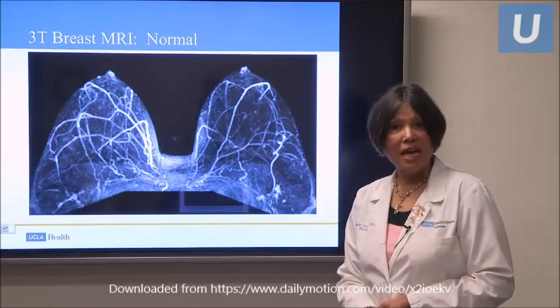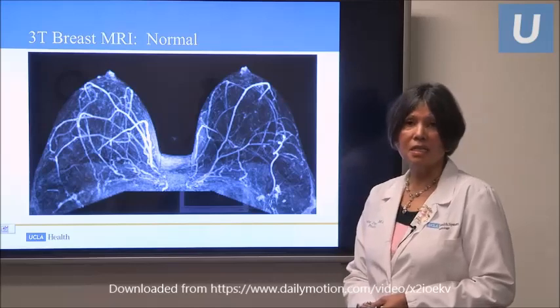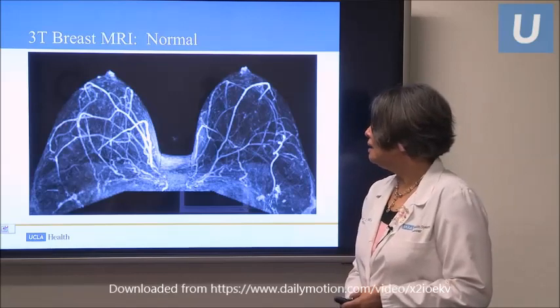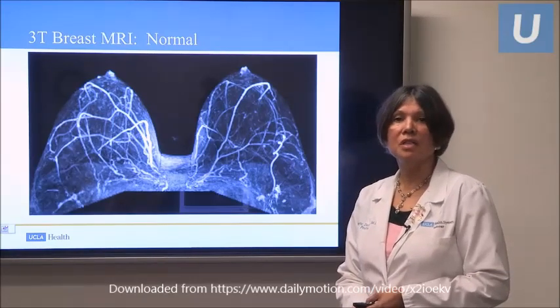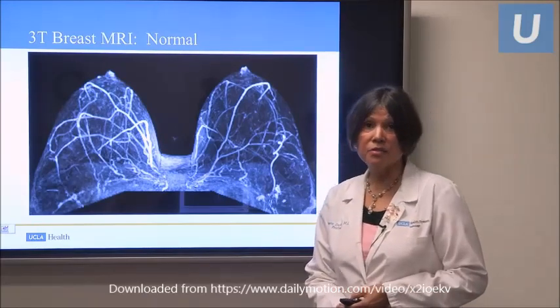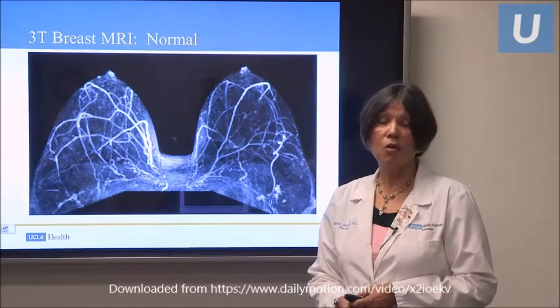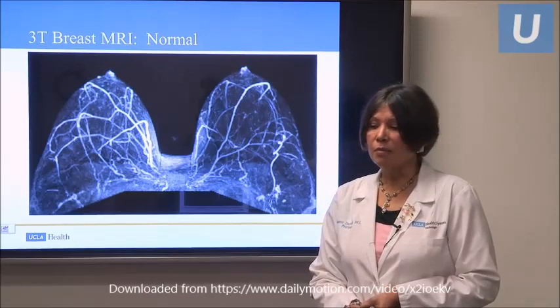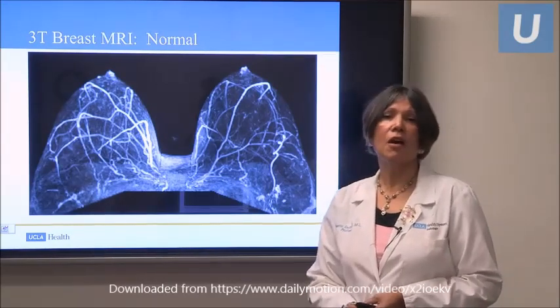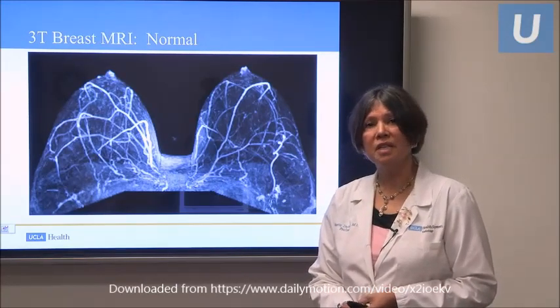To let you know, benign masses can enhance, and postoperative changes can enhance, so it's very, very sensitive. Its specificity is a little less, but it's very important to know that we can see cancers that may not be seen on other imaging studies. There are also cancers, though, that cannot be seen by MR, mammography, or ultrasound. That particular type of cancer is known as lobular cancer. Most cancers are invasive ductal cancers, but there are histology types of cancers that will elude us.